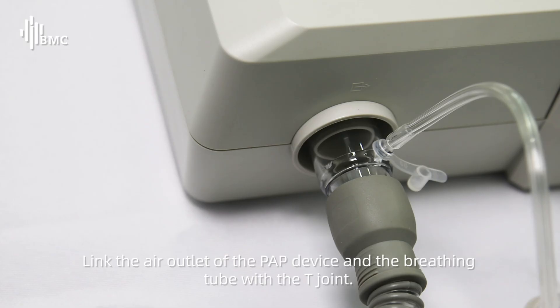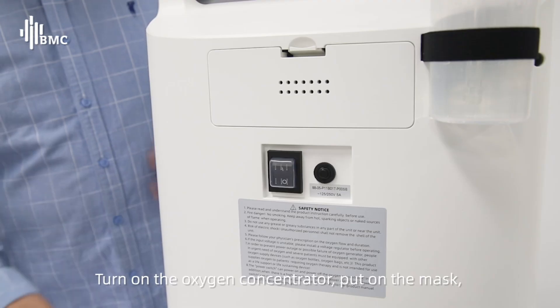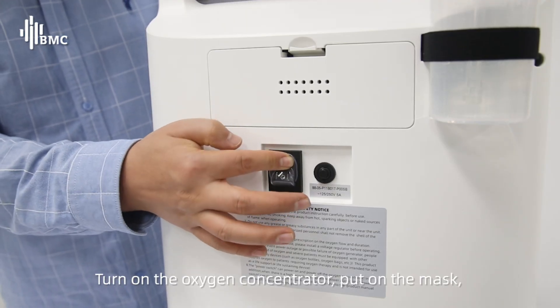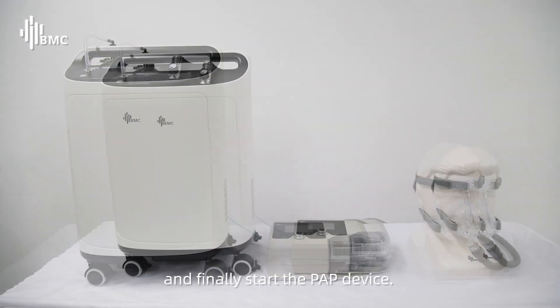Link the air outlet of the PAP device and the breathing tube with the T joint. Connect the air outlet of the oxygen concentrator and the T joint with the oxygen cannula. Turn on the oxygen concentrator, put on the mask, and finally start the PAP device.